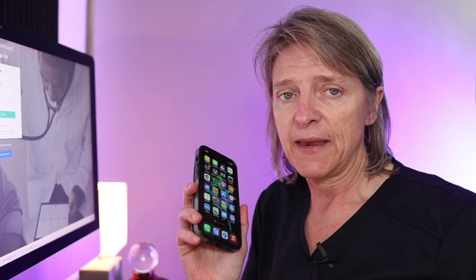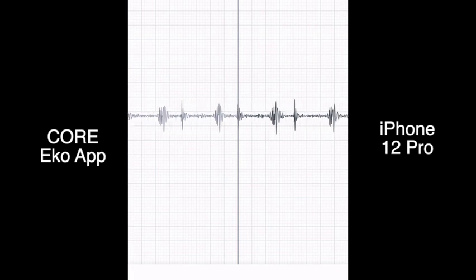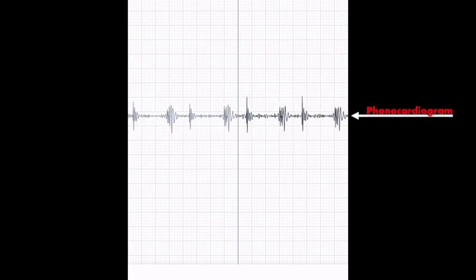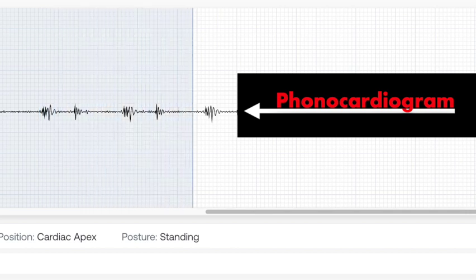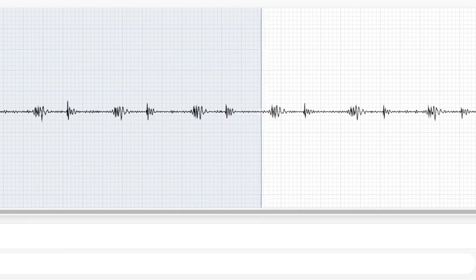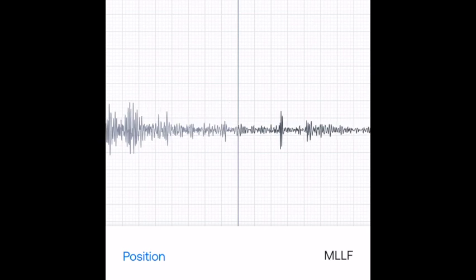Now we're talking about the Core digital stethoscope. Opening the Echo app, you can see the phonocardiogram — take a moment to listen to that rhythm. Next, we'll hop onto the desktop and show you what it looks like on the dashboard. I'll also show you the phonopneumogram, which is the lung sound. That wraps up the Core. Next, we'll get to the Duo.